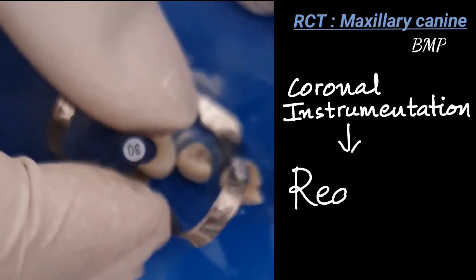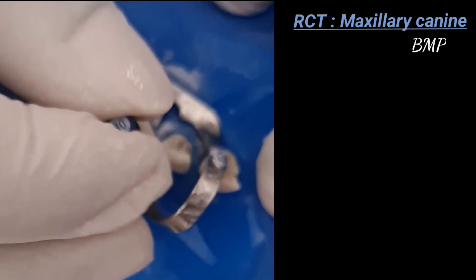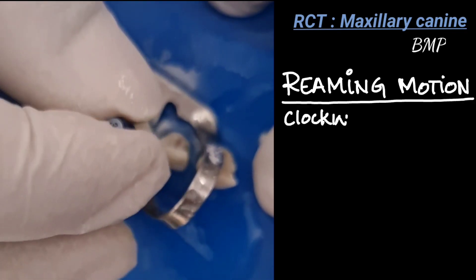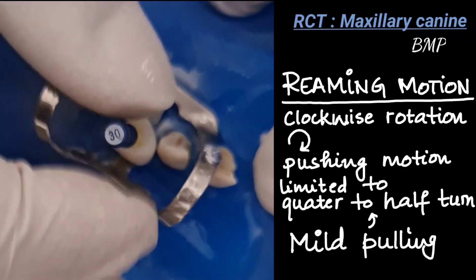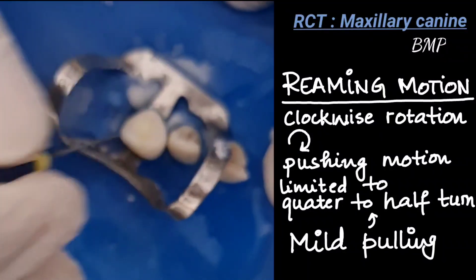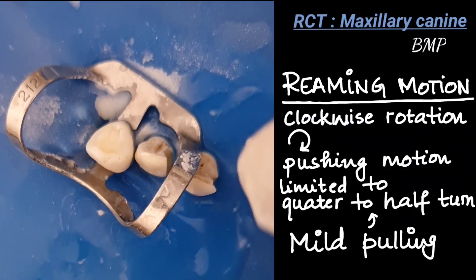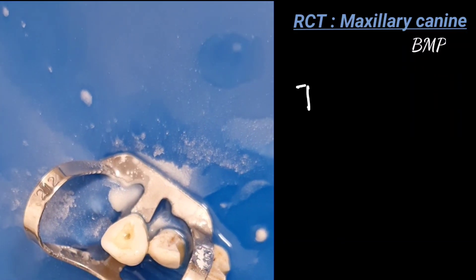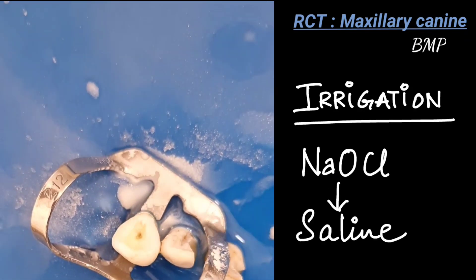Coronal instrumentation is done in a reaming motion. Apical instrumentation uses circumferential filing, while coronal instrumentation uses reaming motion. The reaming motion is a clockwise rotation with a slight pushing motion limited to a quarter to half turn, then disengaging the file with a mild pulling motion. So: clockwise push limited to a quarter to half turn, then counter-clockwise to disengage. Remember to irrigate with sodium hypochlorite and saline alternately.